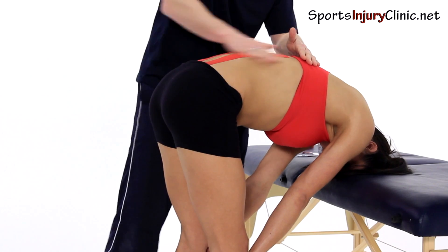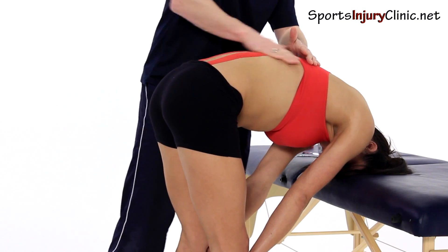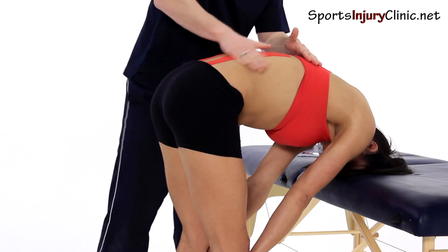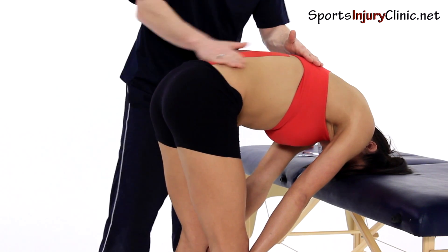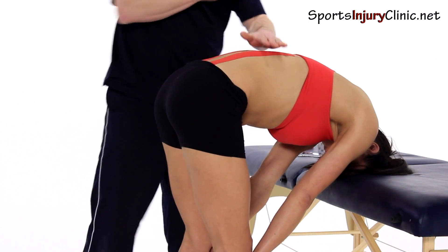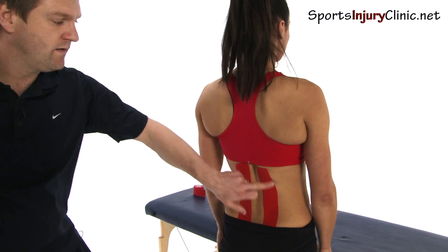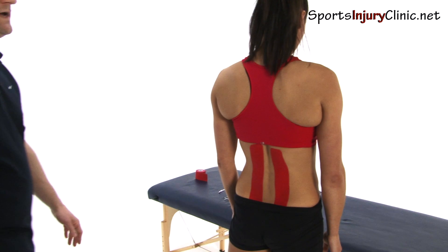You do exactly the same in reverse when you're taking it off. Because it will stick quite a lot, you just rub the muscle, rub the tape again and that will deactivate the glue. Then if you get the patient to stand up, they've now got the myofascial taping in place.